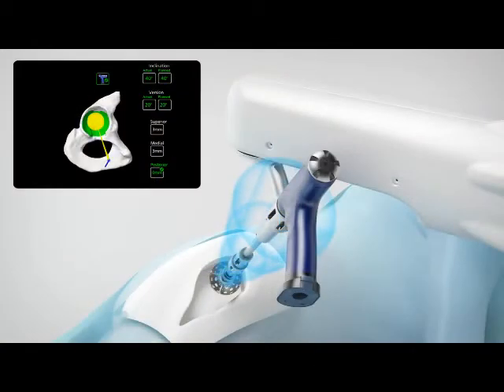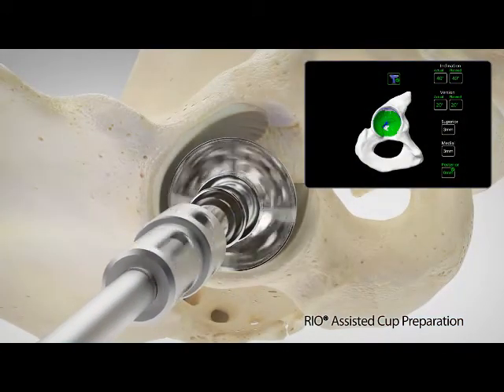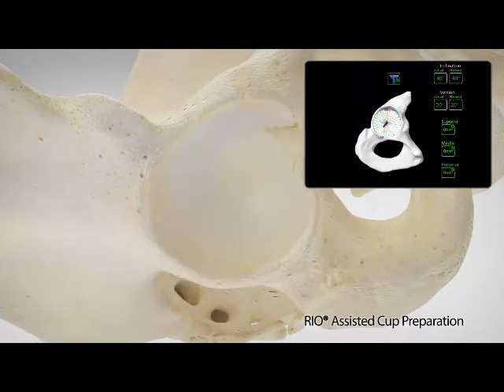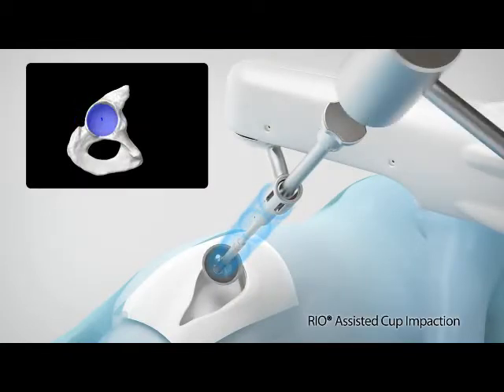During Makoplasty, the Rio provides tactile feedback, 3D visualization, and auditory guidance as the surgeon prepares the acetabulum for the implant. The surgeon is assisted in providing accurate and controlled preparation of the acetabular bone to ensure the cup is placed according to the patient's unique surgical plan.